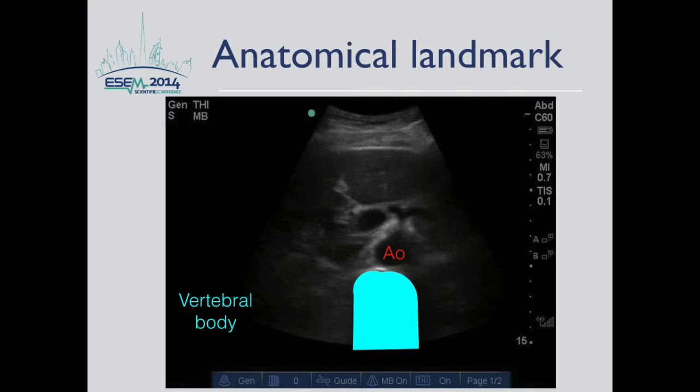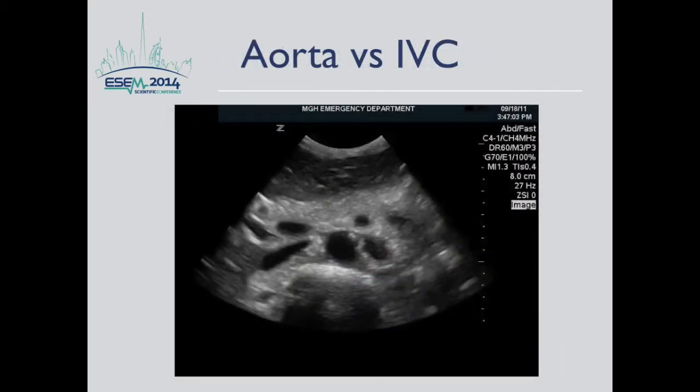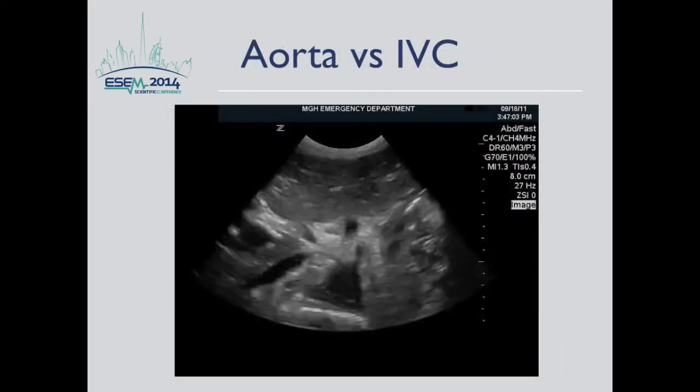On screen, the vena cava is usually noted to be just left to the aorta. This corresponds to the patient's right side when the probe marker faces the patient's right. Because it is a low pressure system, the vena cava often appears triangular or teardrop shaped. The vena cava may be pulsatile because it is close to the abdominal aorta.